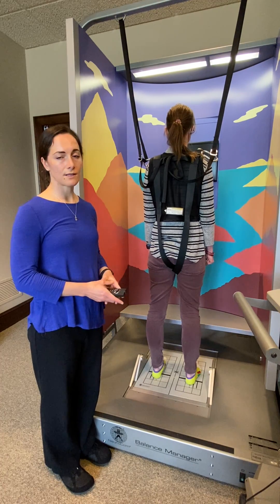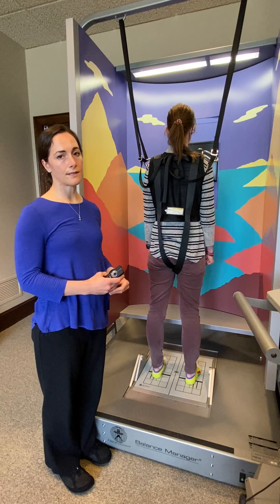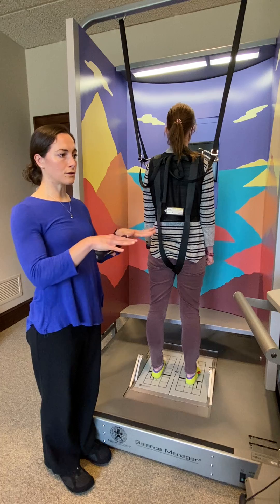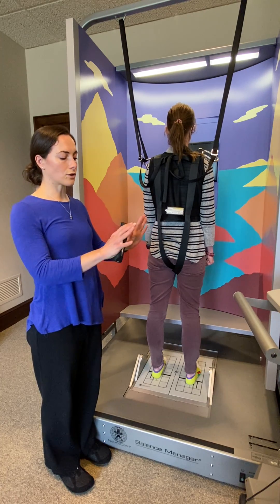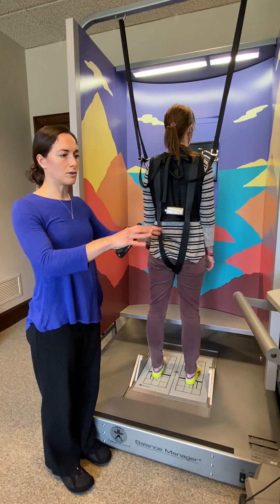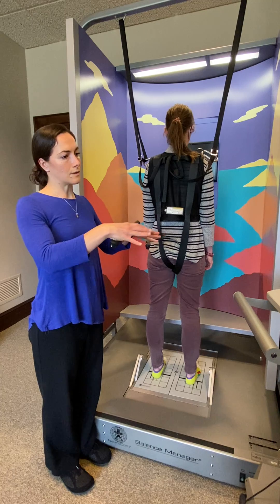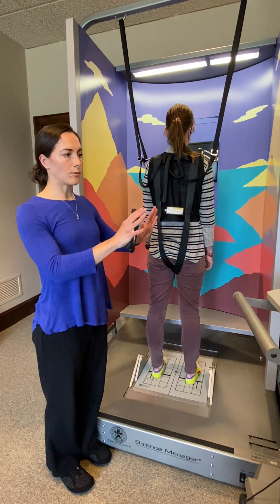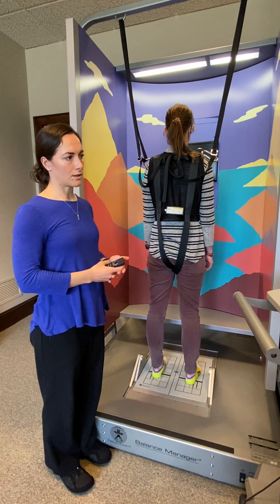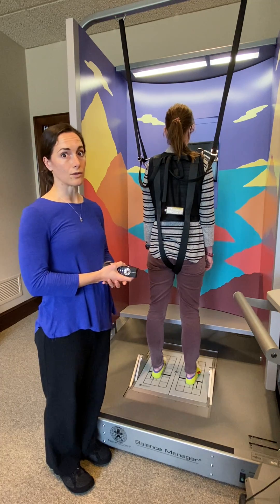This is the adaptation test, the third portion of the computerized dynamic posturography balance test. What this test assesses is your response to a shift in the angle under your feet. So if a rock slides under you and your toes go forward, or say you're walking and a piece of the sidewalk goes backward on you and your toes go up, this test will assess your response to that to see if you're likely to lose your balance if something similar were to happen.